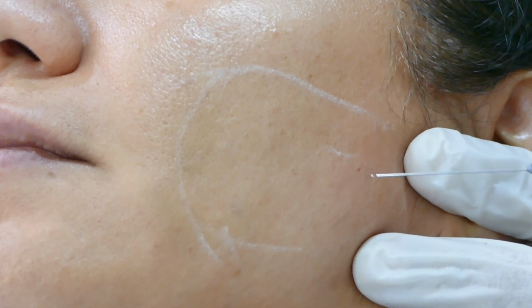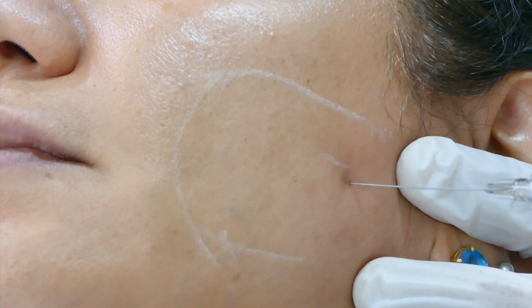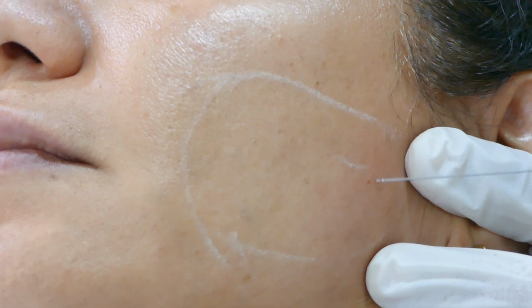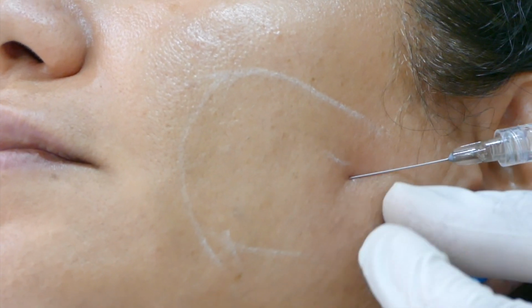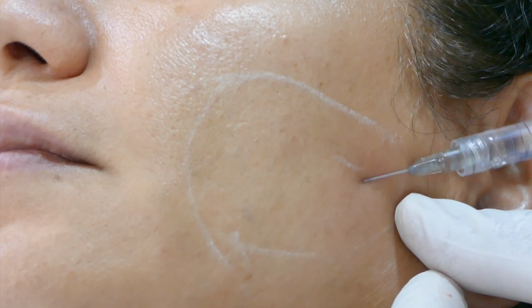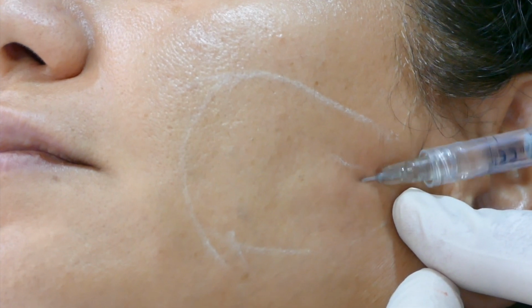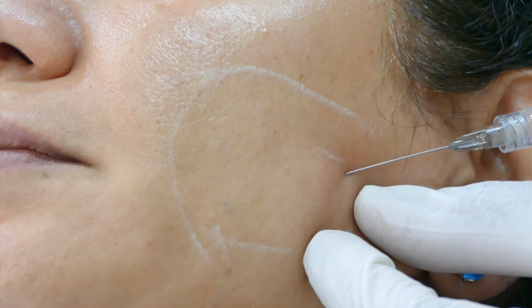If you try to go in this way, you will not be able to enter. If you go this way, you will not be able to enter. So the best angle is 45 degrees. There you are. And you gradually advance. There. And then inject.